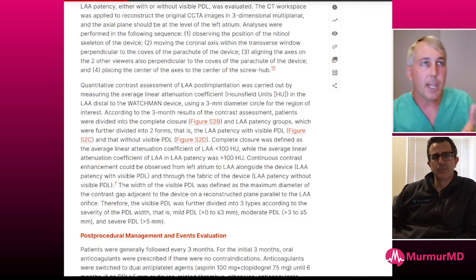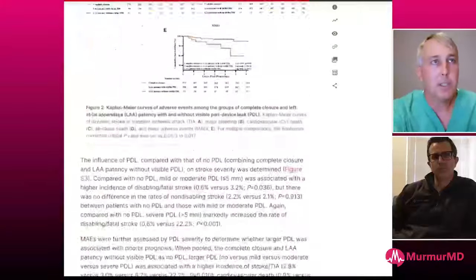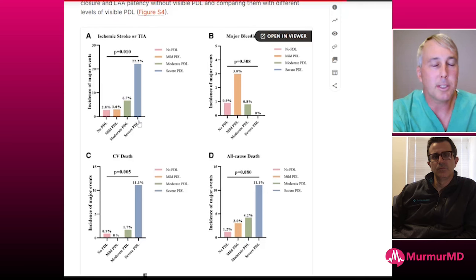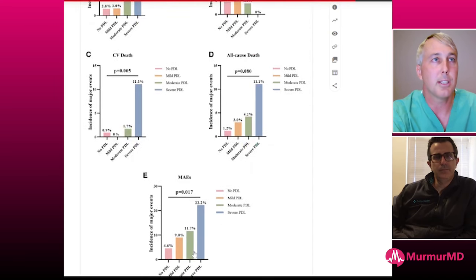So this paper was presented at New York Valves back in April. This is the first time we actually have data after Watchman for CT. All previous to this, everything had been anecdotal. So in this study, importantly, they list out exactly what we did, how you measure and everything. And I could go through that again.